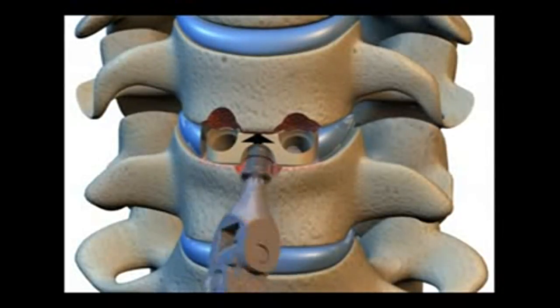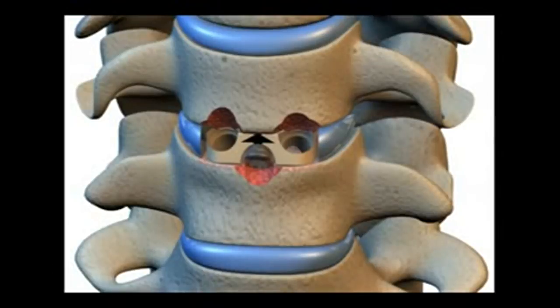Insert the screws, beginning with the central screw, not fully tightening until all three are positioned. Sequentially tighten screws until the implant is secure. Obtain AP and lateral x-rays to confirm final position.